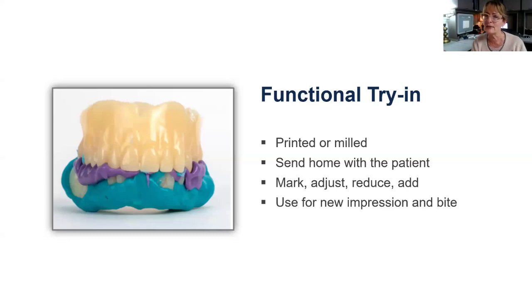But the need to scan everything all the time, like this, for instance, I would put it in a box and send it to the lab. The lab has a desktop scanner that will scan that 3-dimensionally. The same thing as if you ended up with the custom bite block and take the wash impression inside of it and verify vertical so that you have an opposing as well. I would put that in a box and ship it to the lab and let them scan the whole thing 360 degrees, and it'll go directly into the 3Shape design software.